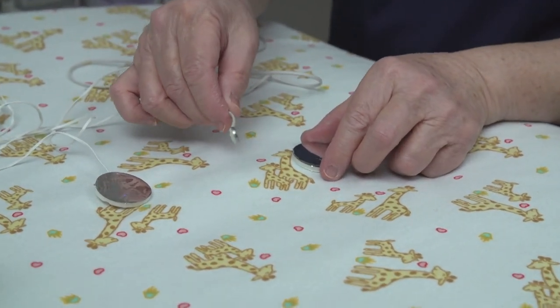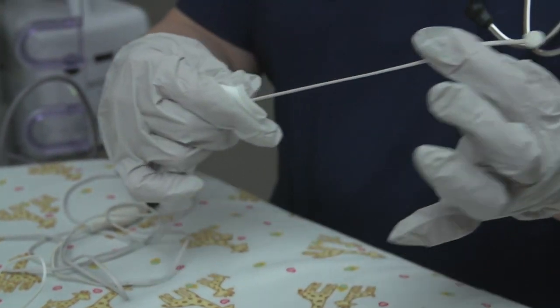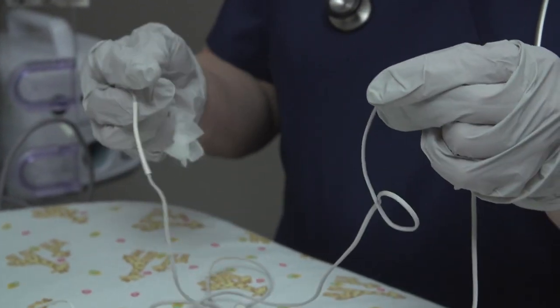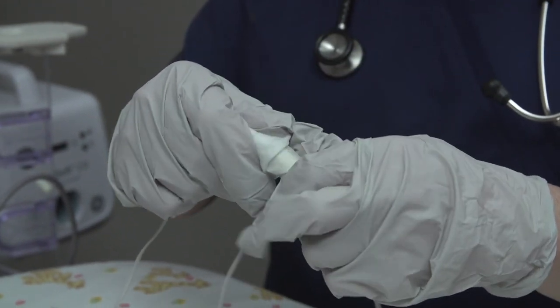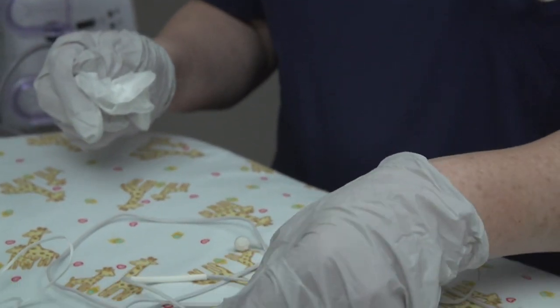The reusable probe has a round metal disc at the patient end. When wiping clean, start at one end of the probe — the tip or the plug — and clean the probe by moving the cloth towards the middle of the cord to the other end. Do not start at the middle of the cord and move the cloth towards the plug or tip end, as this may stress the connection between the cord and the tip or plug.